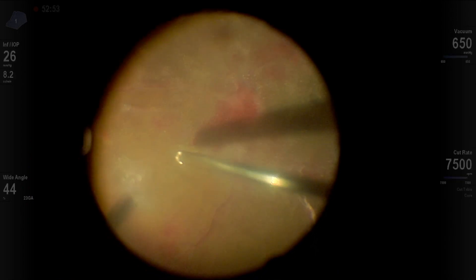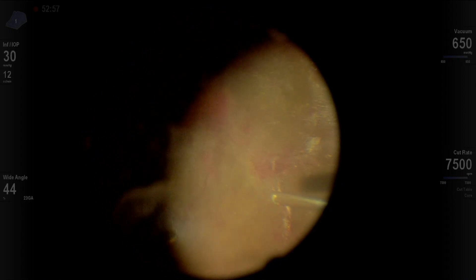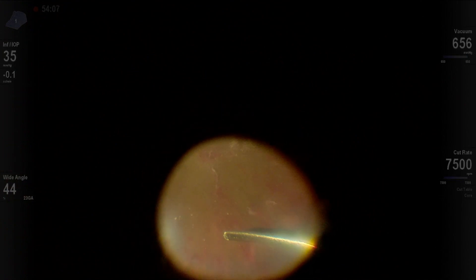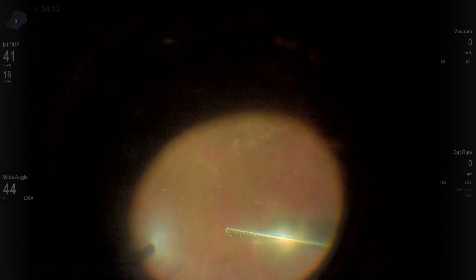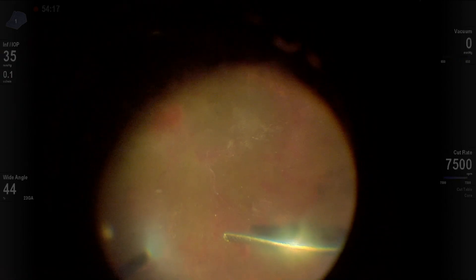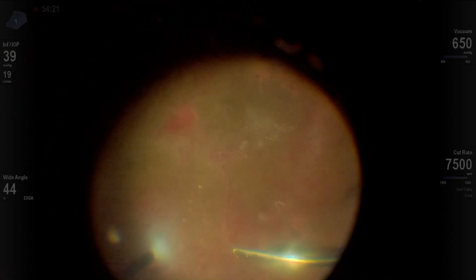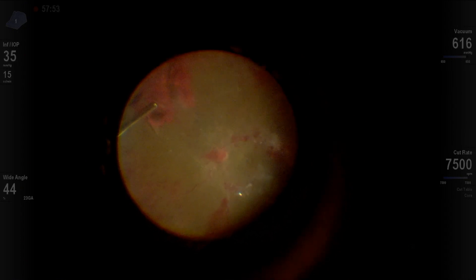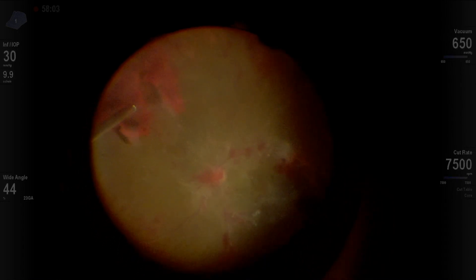Final steps of removing the vitreous — you need to pull to get the peripheral vitreous up. How much you pull is a judgment call; always pull away from epicenters and then come to the epicenters. Sometimes it's attached to one epicenter and when you cut it, it relaxes and detaches more. Just cut very near to the retina until you detach. You can see the hemorrhage and the hyaloid adherent in the periphery, and the nice thing about the 23 gauge cutter is that its larger sphere of influence makes it more effective to get that up compared to 25 or 27 gauge.